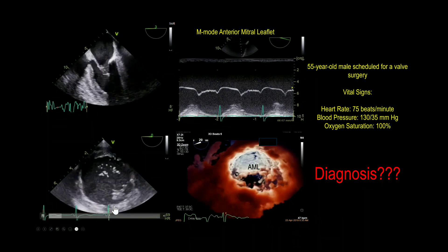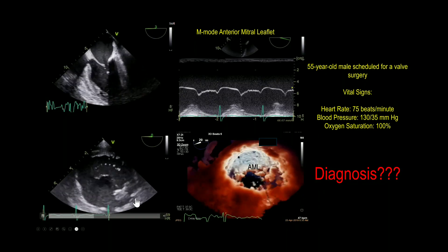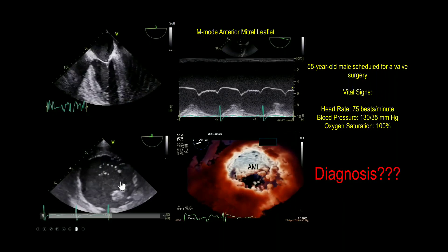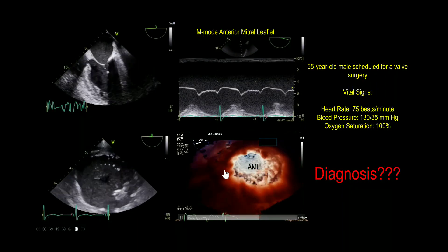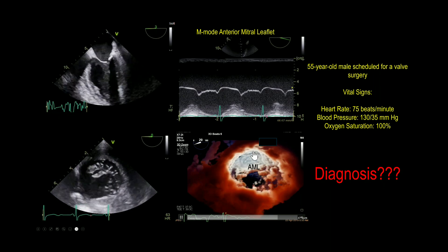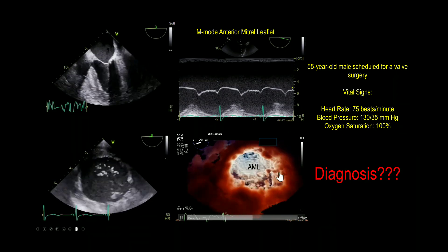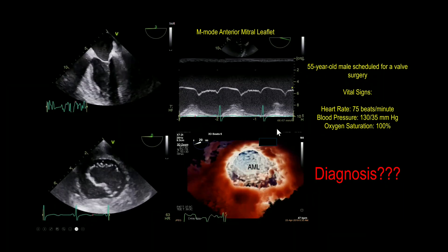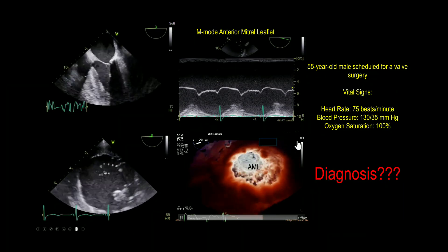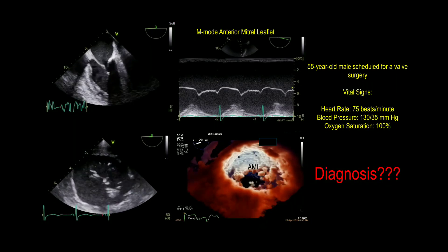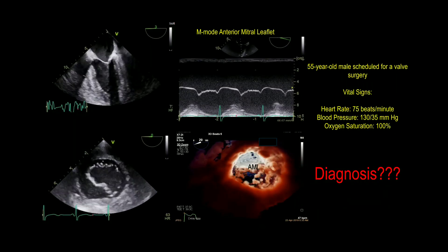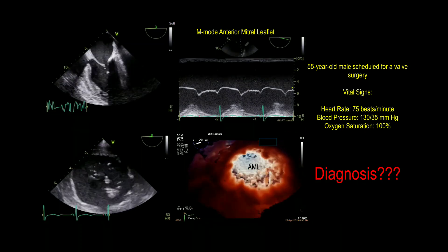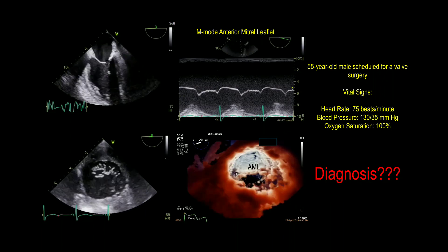This is the transgastric basal short axis showing the fish-mouth view of the mitral valve. And this is a three-dimensional rendition of the basal short axis showing the anterior mitral leaflet, the LVOT, the aortic valve, and the walls of the LV. You're now expected to make a diagnosis based on this history and these images — take a good look. It's obvious in both the history and the images; put them together and you can make the diagnosis.